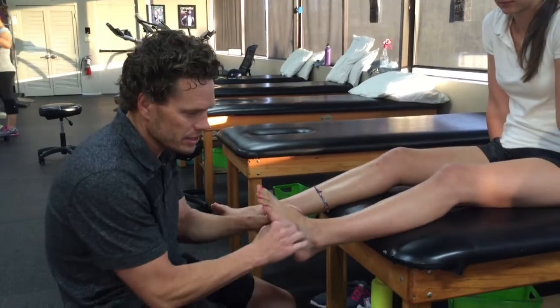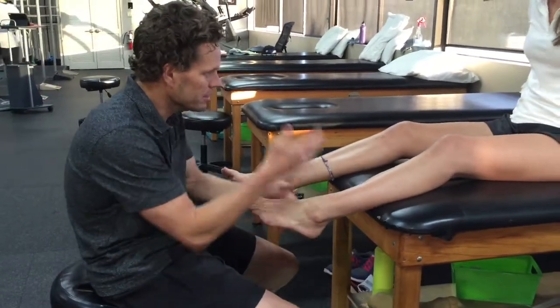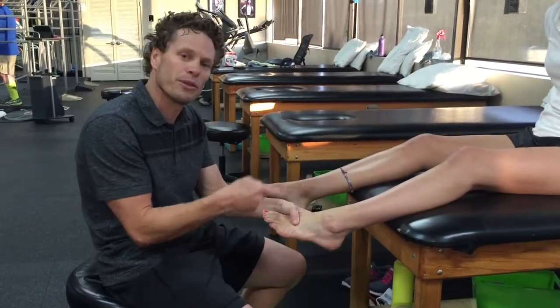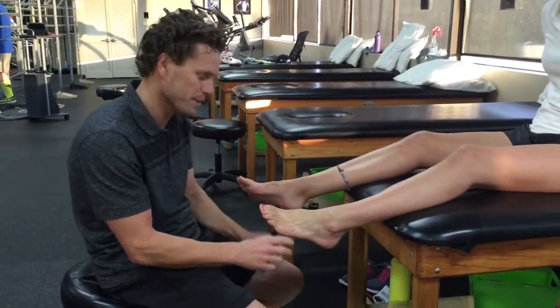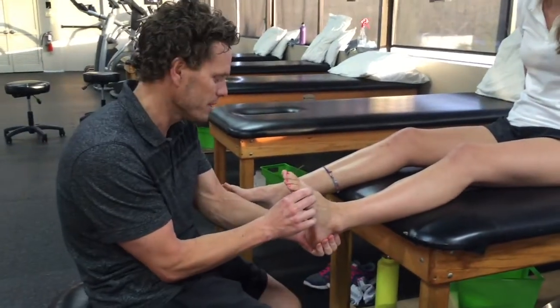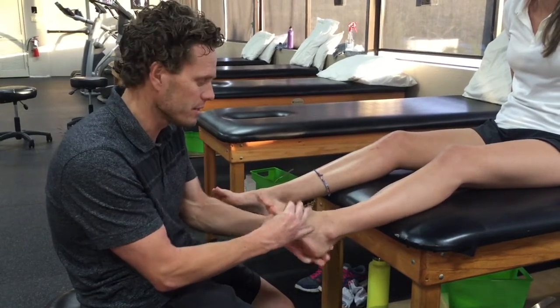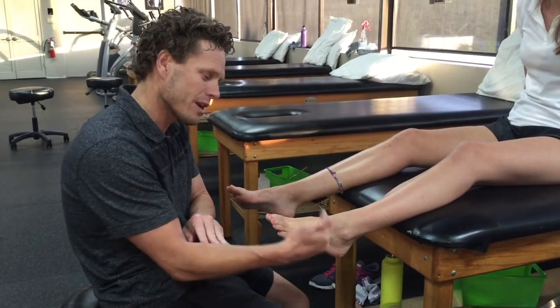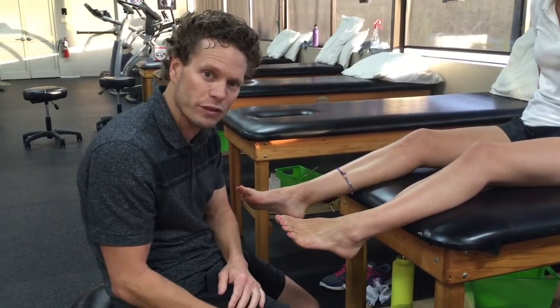We always get someone barefoot. This is Sam — she's going to help us out today. We do an assessment both non-weight bearing and weight bearing. It's really vital to look at the foot in a non-weight bearing position to see if it has structural deformities. Once we determine that, we'll also look at the response or the compensations that occur once the foot's on the ground.